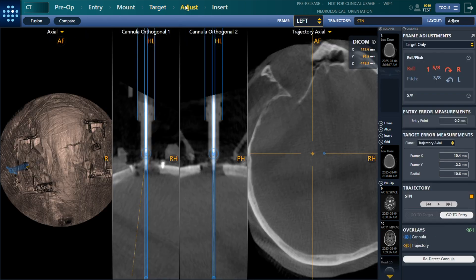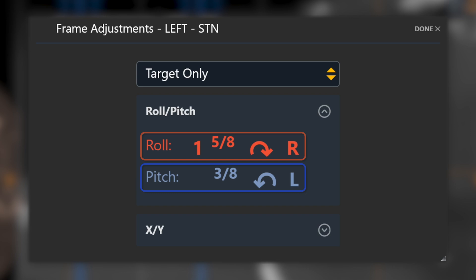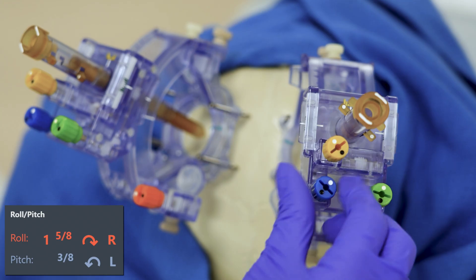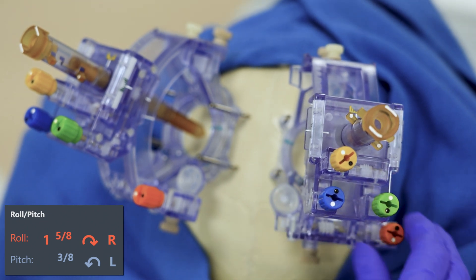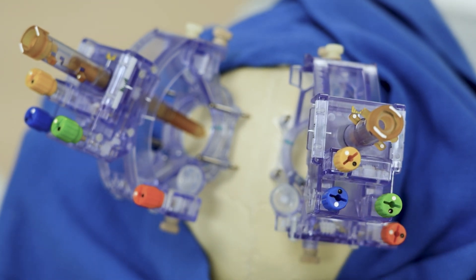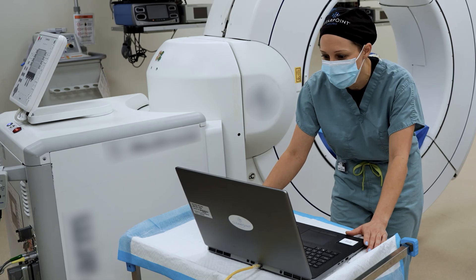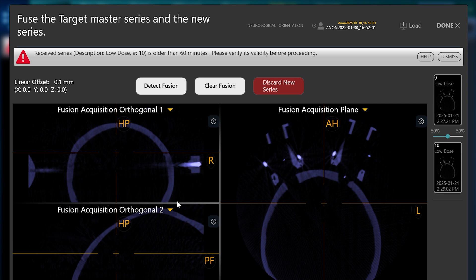The software creates a forward projection of the frame's trajectory and compares that to the plan. It calculates automated instructions to fine-tune alignment, providing control to the user for dialed-in delivery and precision at every turn. The surgeon may elect to scan again prior to insertion for verification. After the frame is aligned, the adjustment process is complete.